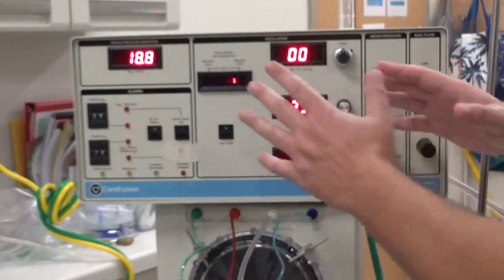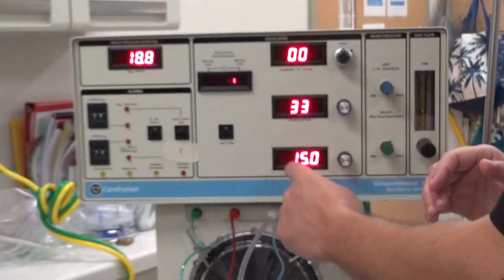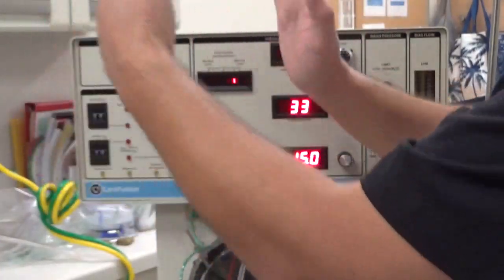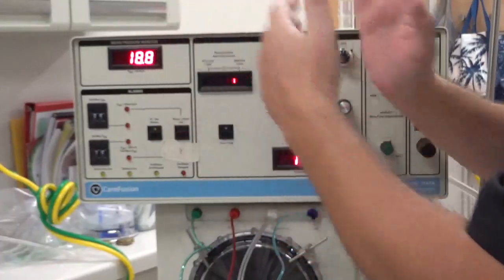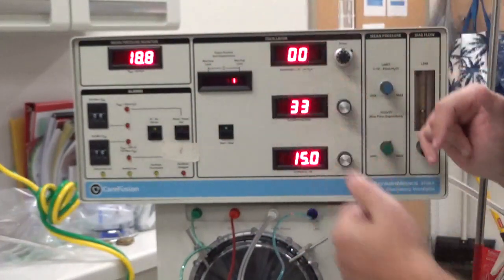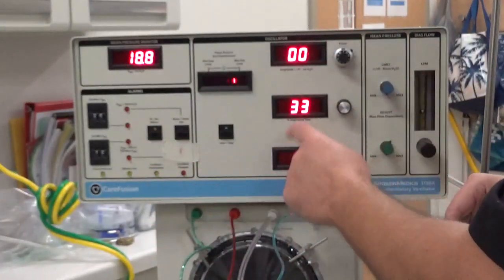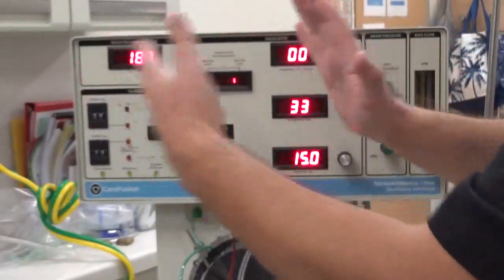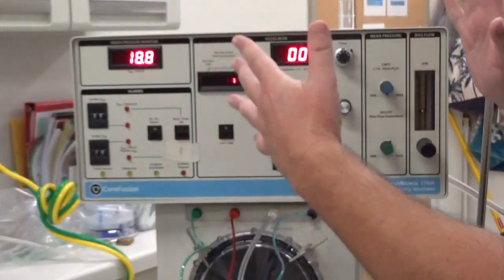The reason is basically that inspiratory time is a percentage of our rate. Each hertz is a little breath, and each little breath has 0.33 I time and 0.67 expiratory time. I don't know what the actual number is because it's a percent of this hertz. So just know that there's about a 1 to 2 IE ratio.